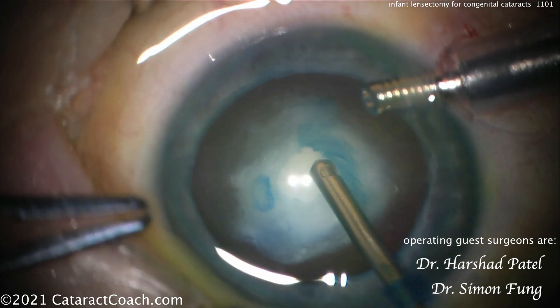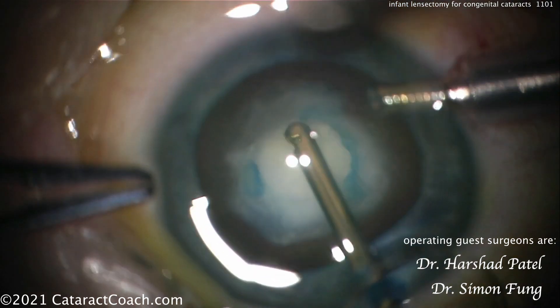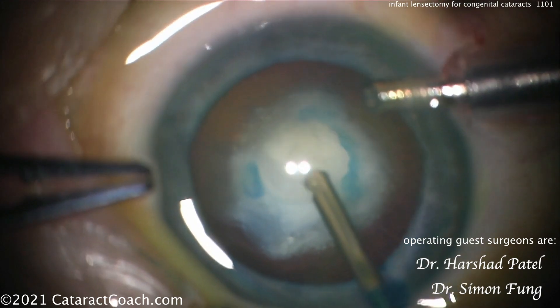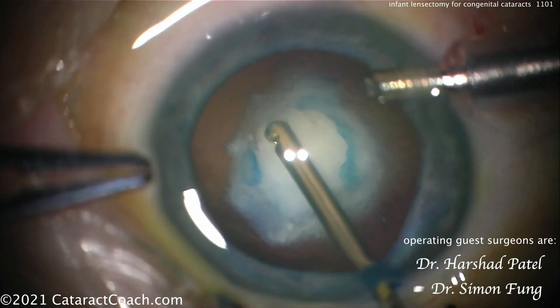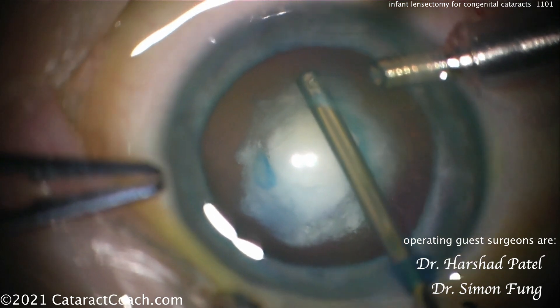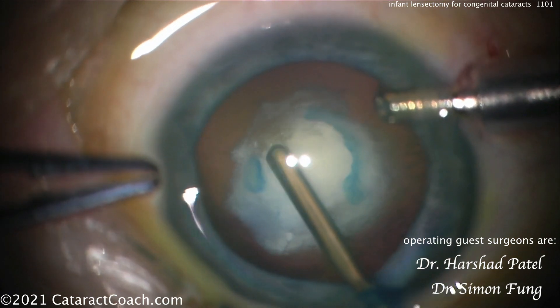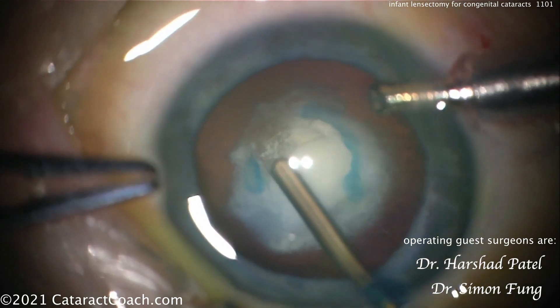This is another technique that works very well — just taking your time and using the vitrector. Important when using the vitrector: understand the difference in settings. There is the IA cut setting — irrigation is position one, aspiration is position two, and position three is the cutter. That may be the useful technique for removing the lens material. But in this baby we're also going to have to open the posterior capsule and do an anterior vitrectomy. For the anterior vitrectomy, you want to be on the anterior vitrectomy mode: position one is irrigation, position two is the vitreous cutter, and position three is aspiration.